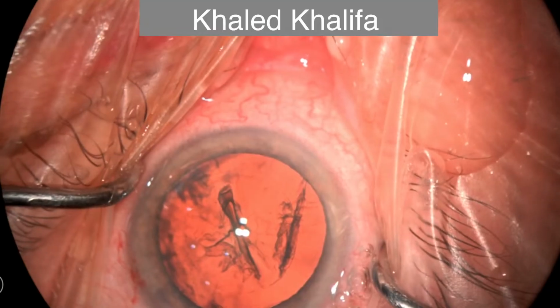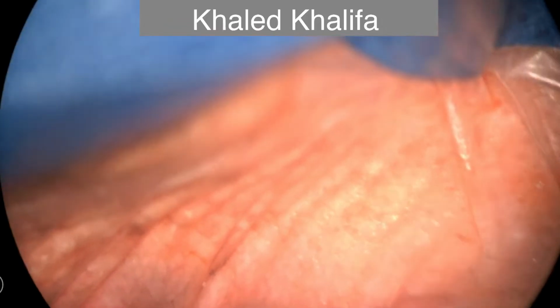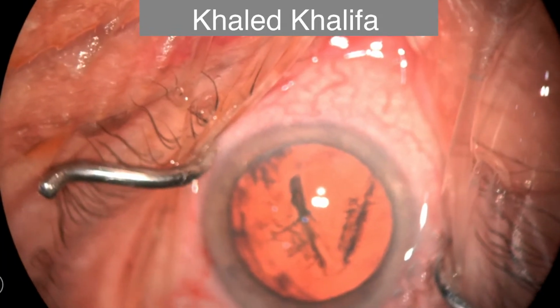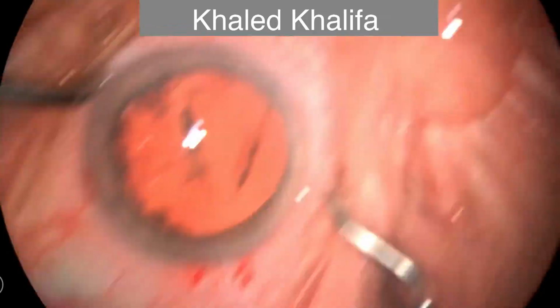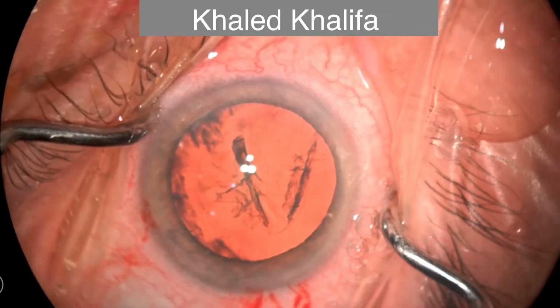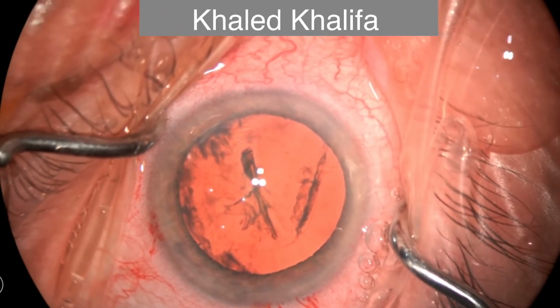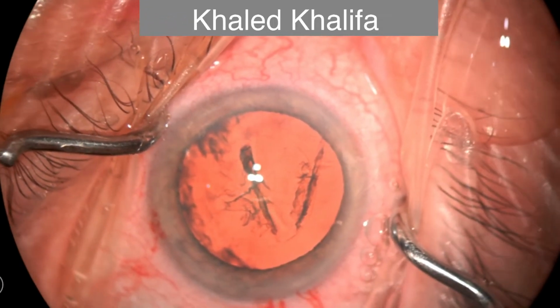This will be much better for engagement of the probe into the anterior chamber. Now I'm adjusting the head of my patient again. And this is the step of phacoemulsification.